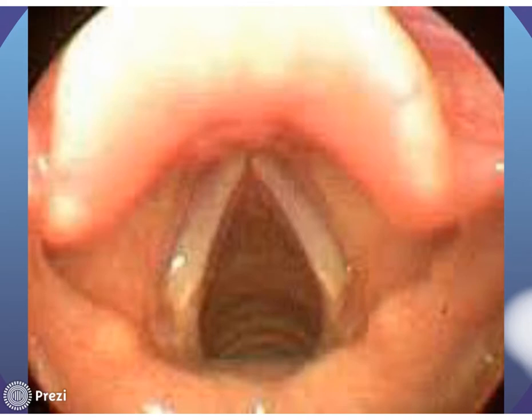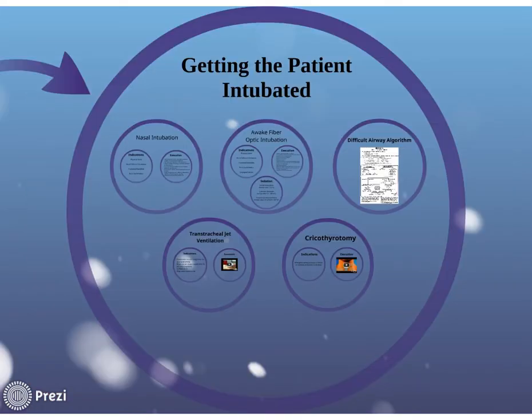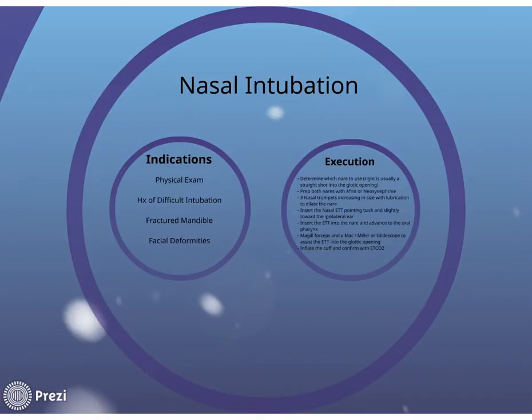All right, how are we going to get intubated? All right, nasal intubation. When do we do it? How do we decide if we want to do it? A lot of times when you do your physical exam, you're going to go, oh, I guess we're going to have to do this nasal intubation. Most of the time, you won't have to make that determination just on the physical exam. It'll be based on the surgery that you're doing typically. So, if they've had a difficult intubation before orally, you might do it. Anytime you've got fractured bones in the face, mandible, yes.